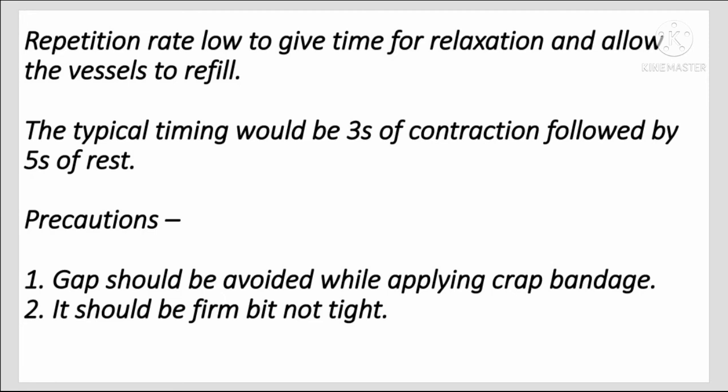This allows the vessels to refill. The typical timing would be three seconds of contraction followed by five seconds of rest. Precaution: gaps should be avoided while applying the crepe bandage — it should be firm but not tight.